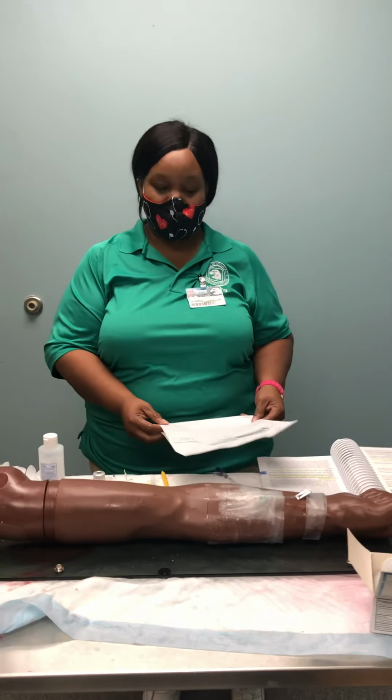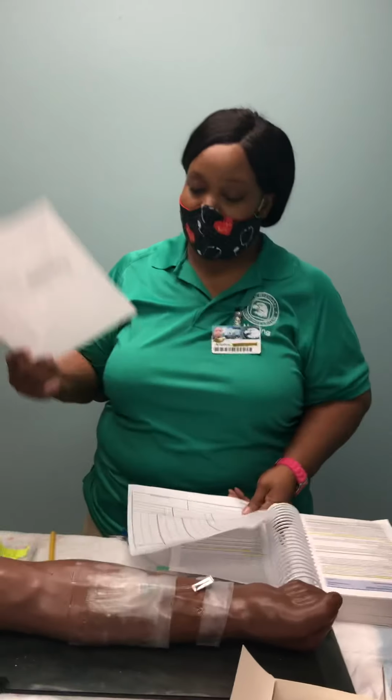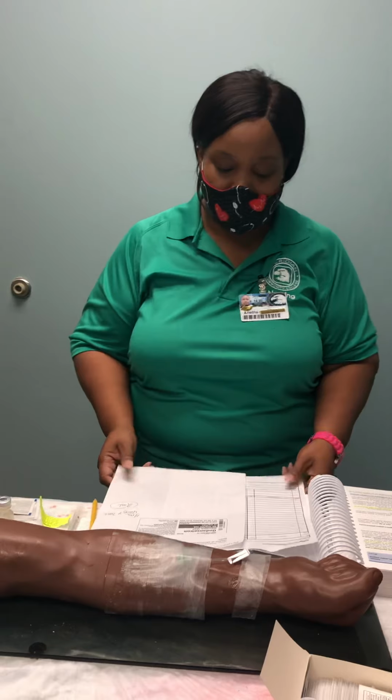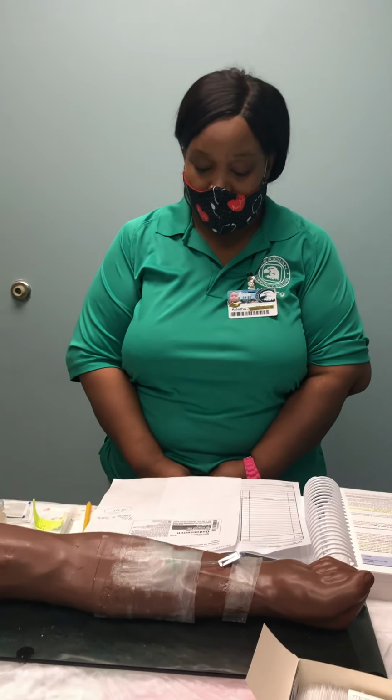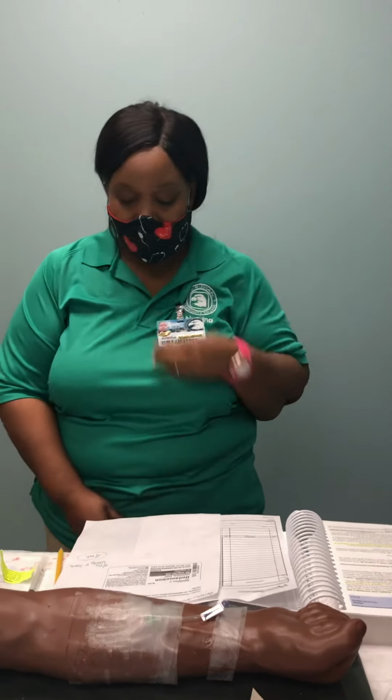I will be doing an IV push. I will check my doctor's order with my MAR. The doctor ordered Zofran 4 milligram IV push now.